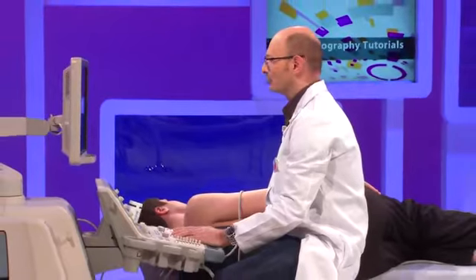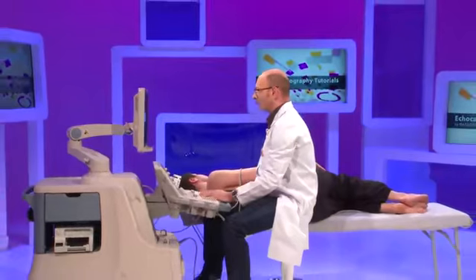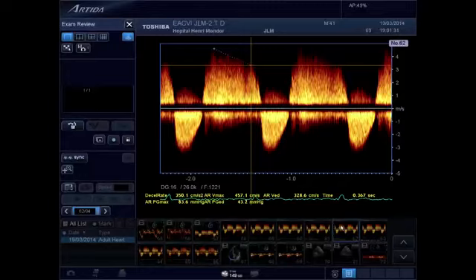which supports mild obstruction in this patient, as we consider that severe obstruction for a subaortic membrane is when the mean gradient is over 50 millimeters of mercury. We will go back to the diastolic flow to measure the pressure half time of the aortic regurgitation.